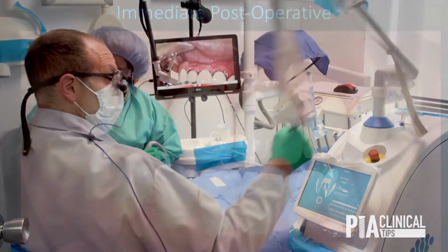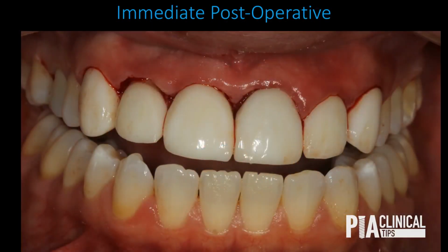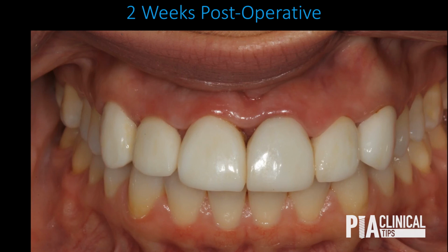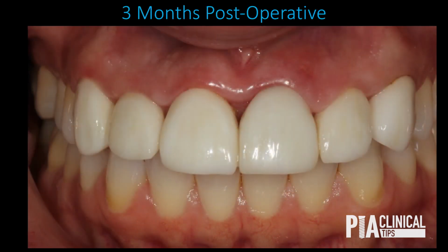Now you can see here, I have a nice architecture, and the case is then finished and given 2 weeks to heal. And here is the case at 3 months post crown lengthening. You can see a nice resolution of the inflammation of the tissue, a nice tissue tone. Although you can see some loss of a papilla, that is to be expected; this patient is scheduled to get new restorations and new veneers around her teeth.